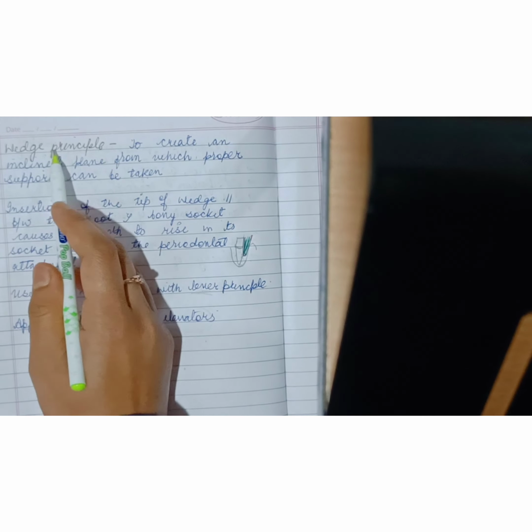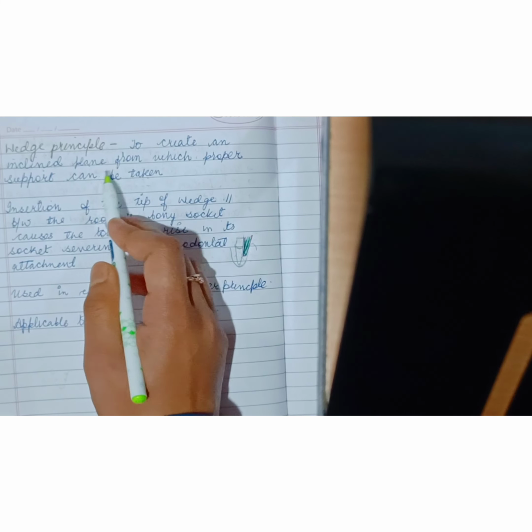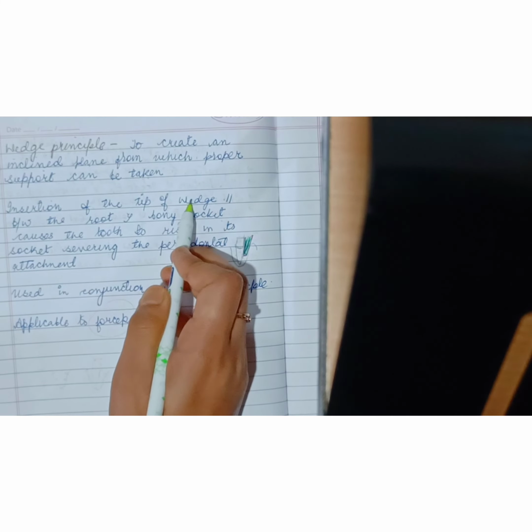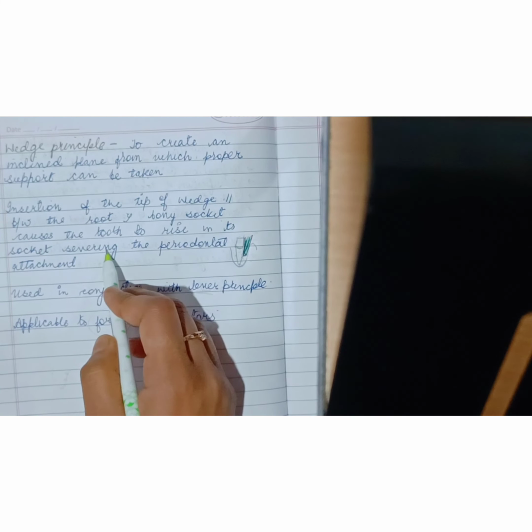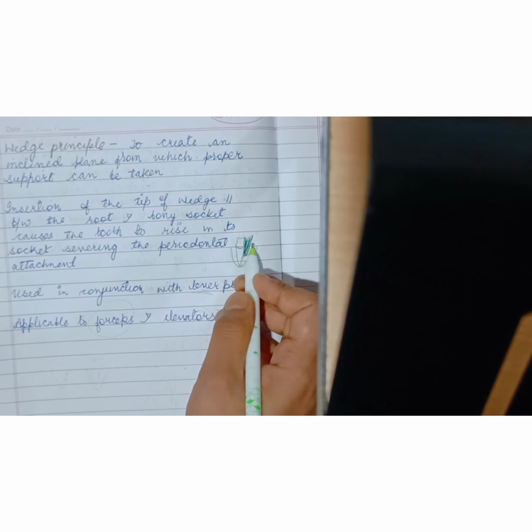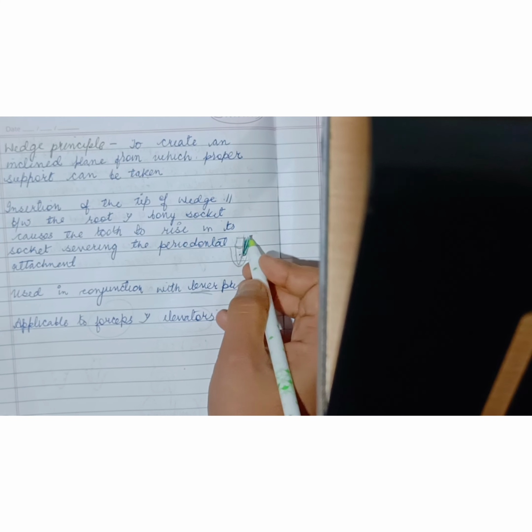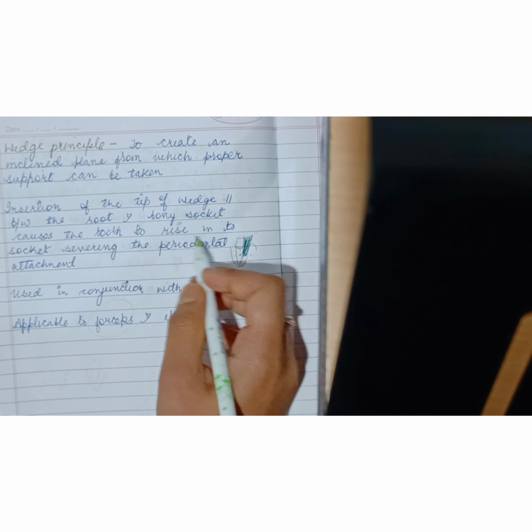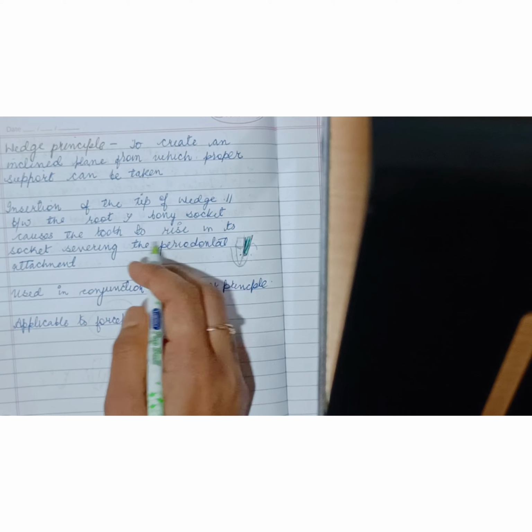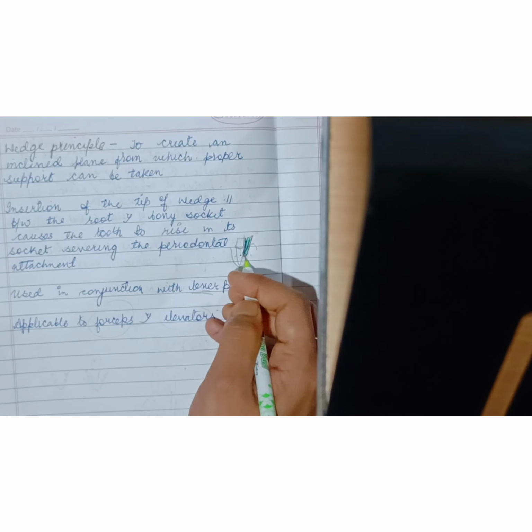The next principle is the wedge principle. To create an inclined plane from which proper support can be taken, insertion of the tip of the wedge parallel between the root and the bony socket causes the tooth to rise in its socket, severing the periodontal attachment. That is, the tip of the wedge, that is the elevator, we insert it in between the root and the socket, which creates an inclined plane for the tooth, and the tooth will rise in the socket, severing the periodontal attachment. We know that the tooth is attached to the bony socket with the help of periodontal fibers.